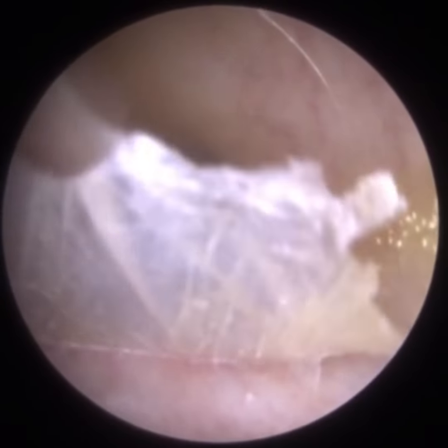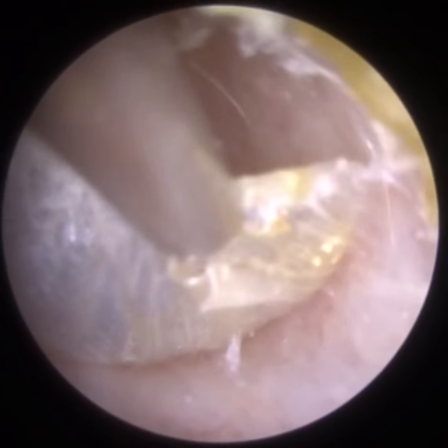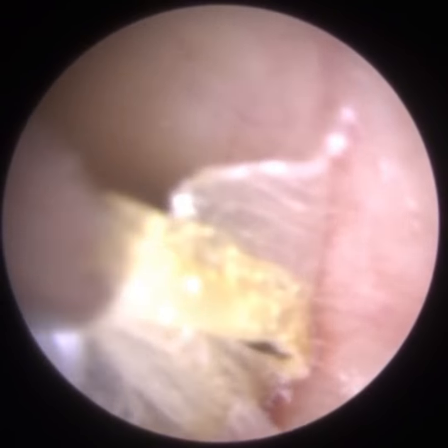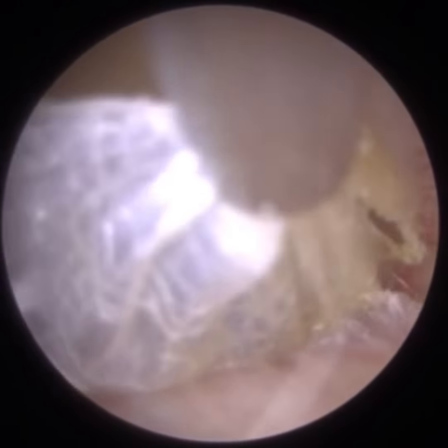So just to the right, we're going to be peeling it off now, so you'll see the underneath trail. It's quite distinctive. There we are. It's almost like a glitter effect. So that's a good image and video of the migration route, and you get loads of these. It's just not one path, you get multiple paths, and you don't normally see it. Only in some cases you can see it.